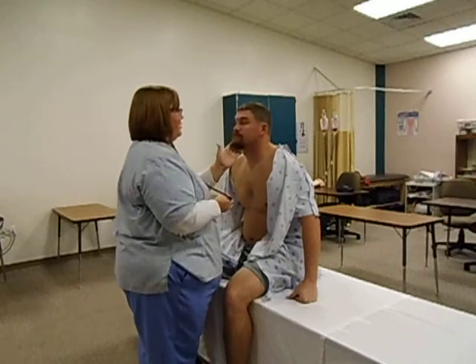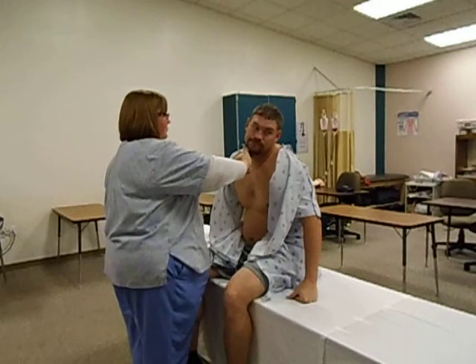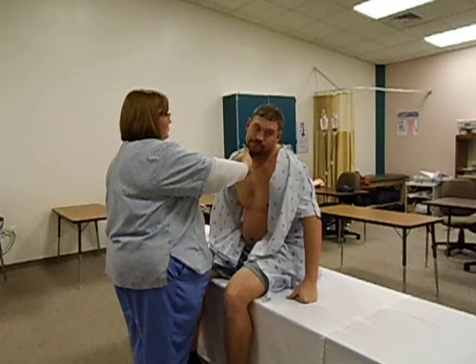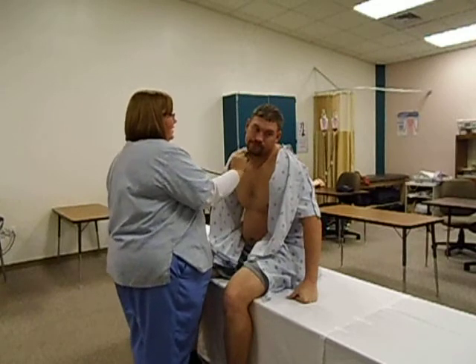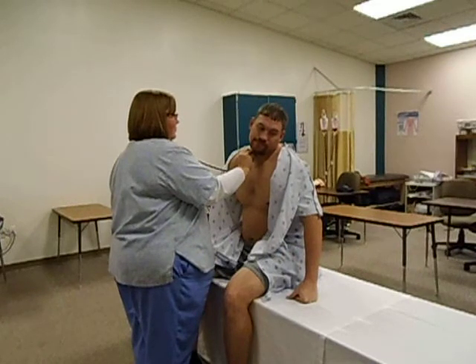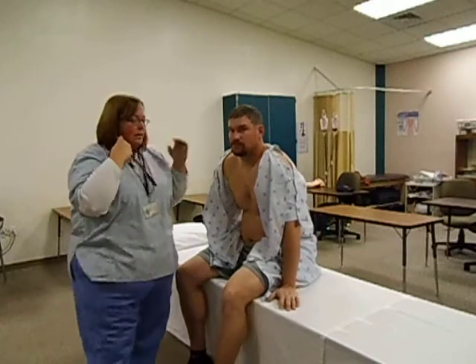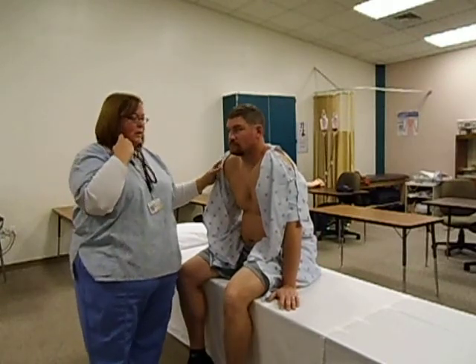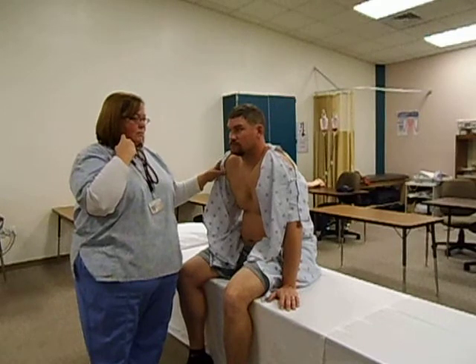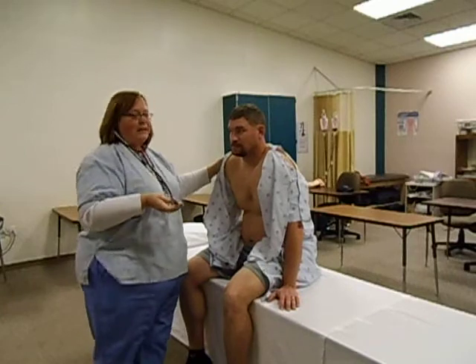There are no bruits heard. If you will, take a deep breath in and hold it. Okay, no bruits heard there. Now we are going to auscultate the heart for the rate, rhythm, and intensity.